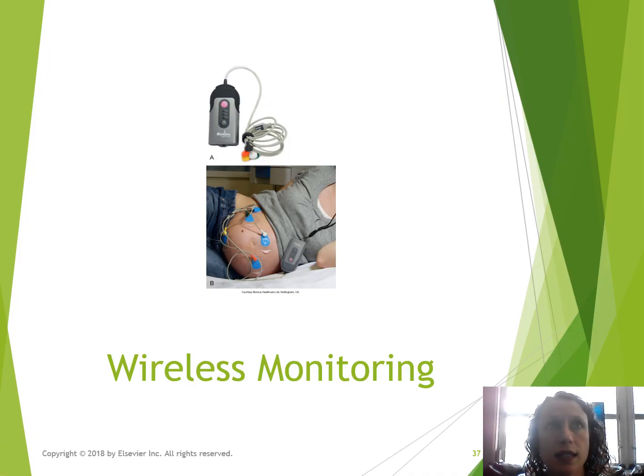So it has to be used for a singleton pregnancy, and it's not recommended for preterm still. I'm sure more research is probably being done, but right now it's only for full term and only for a singleton pregnancy. And it is really neat. They can walk around, they can move around. It does have restrictions depending on the Wi-Fi, because that's what it goes off, Bluetooth.